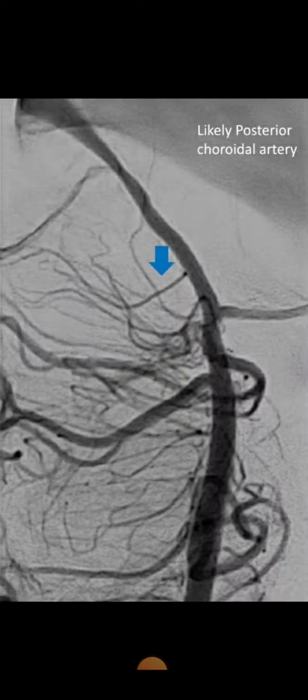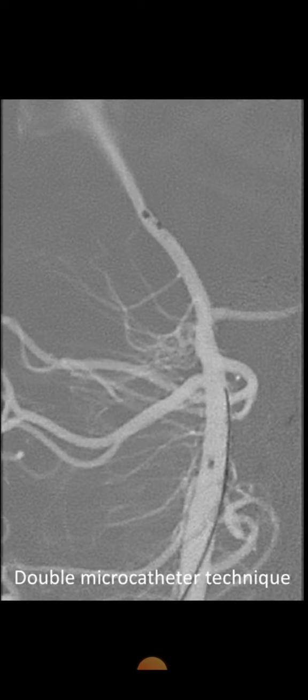This is the 3D rotational angiography, and a directed run shows a choroidal artery arising from the P2 segment of the PCA. Because of the distortion of the anatomy, it appeared that this could potentially be a medial posterior choroidal rather than a lateral posterior choroidal artery. Every effort should be made to preserve this artery, and therefore we used a double microcatheter technique.